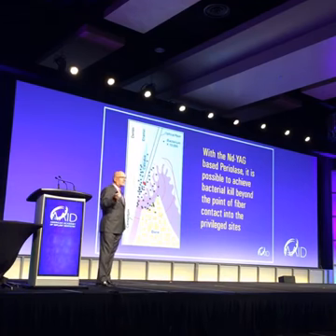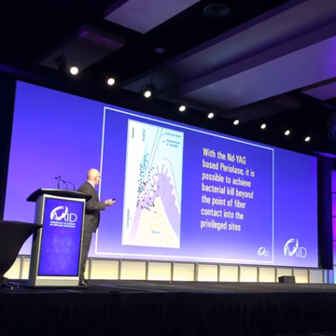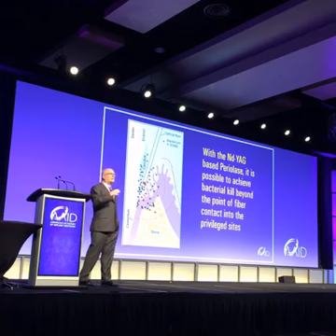So in this little cartoon, the little spiders represent bacteria, and you can see here it's getting in the bone, in the cementum, in the calculus, in everything. It's like a little nuclear blast past the point of contact.